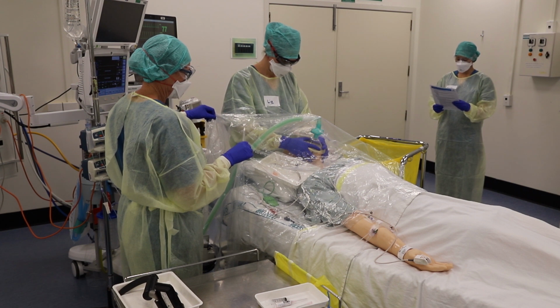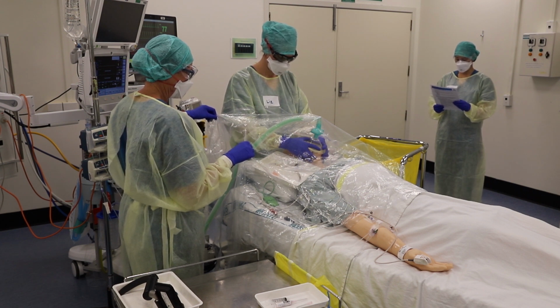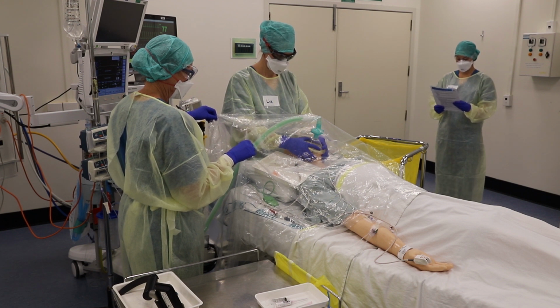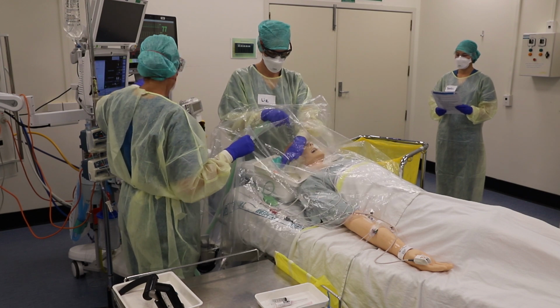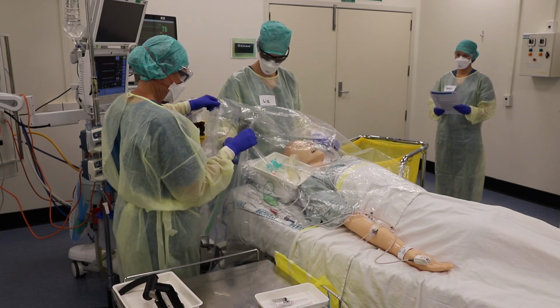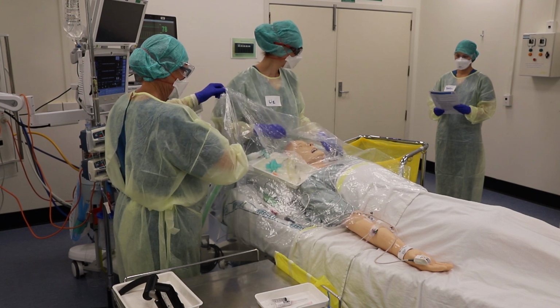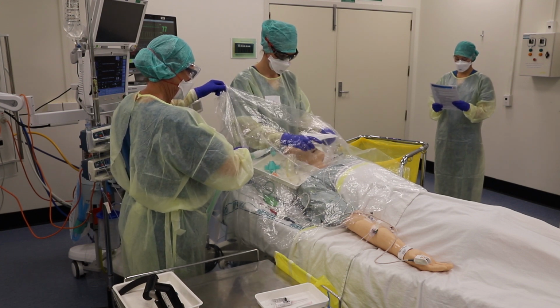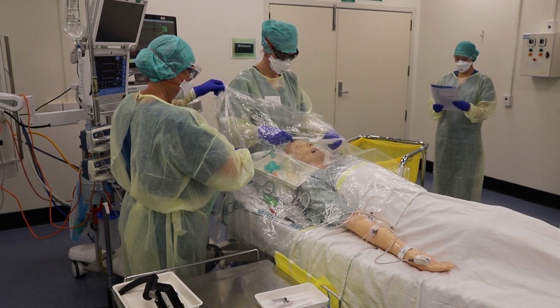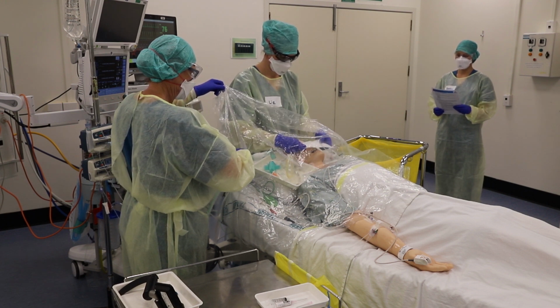When appropriate, face mask is removed and placed with filter into dirty tray under plastic drape. Tech ends case on ventilator. That's done. Apply surgical mask. Hudson mask to be placed over surgical mask. Turn on auxiliary oxygen supply.